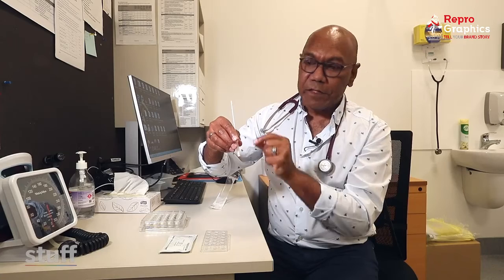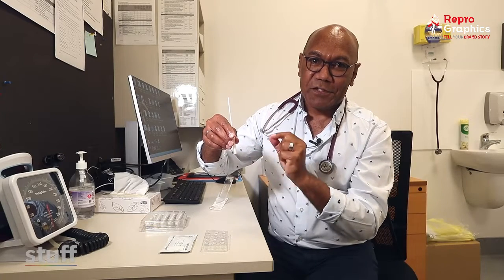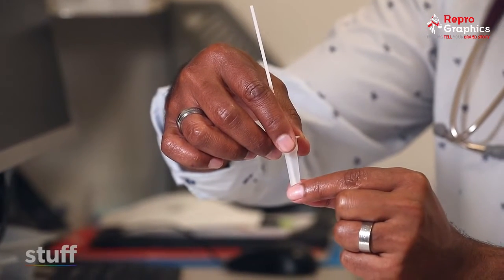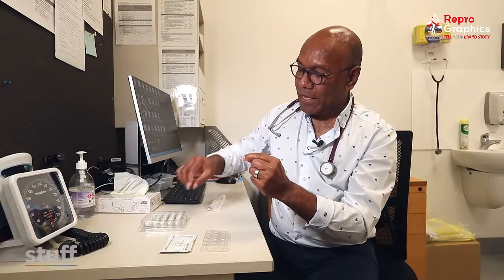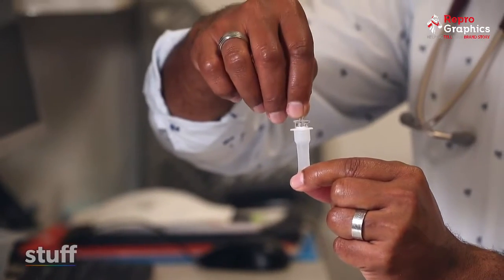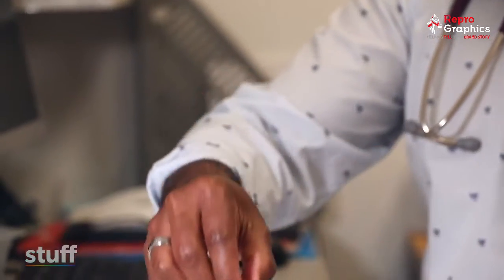Then you want to remove the swab, but you want to squeeze it at the bottom, where the soft part of the swab is with the solution, squeezing and pulling out. Taking the swab away, and you have one of the stoppers available to put on the top. And that can sit there.